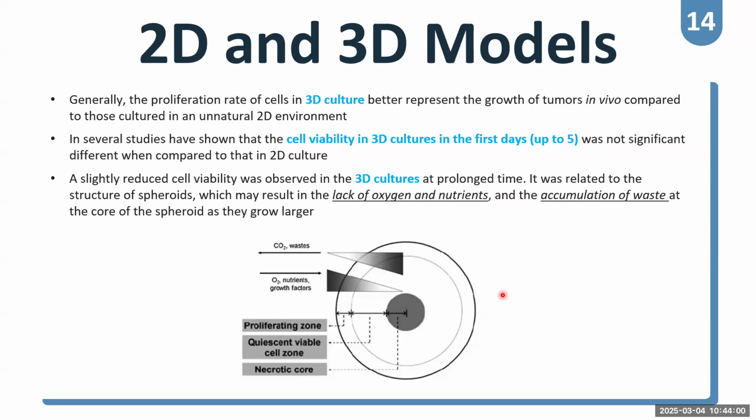And after that, once you get results showing a stable period for culturing the organoid, you can store them in liquid nitrogen, something like that. And then after that, if the doctor wants to test again, you can revive the stocked organoid and test the drug, using the data that you recorded on how it's going and how many days they take to duplicate and proliferate.